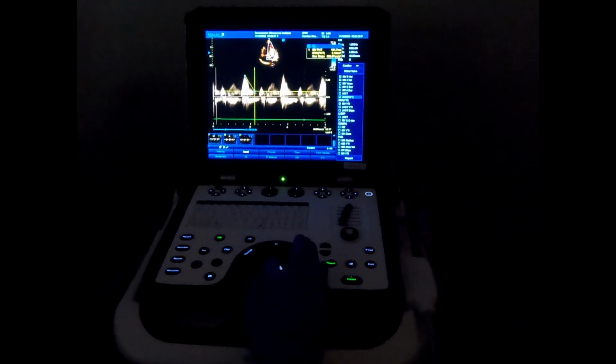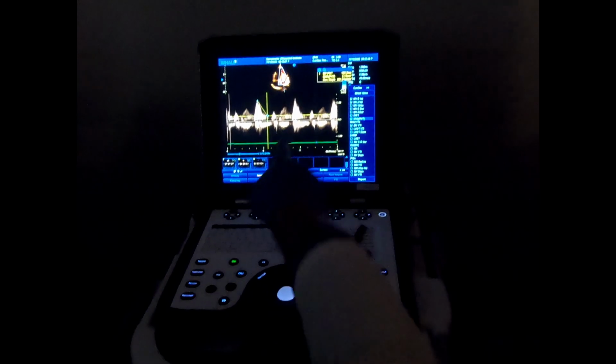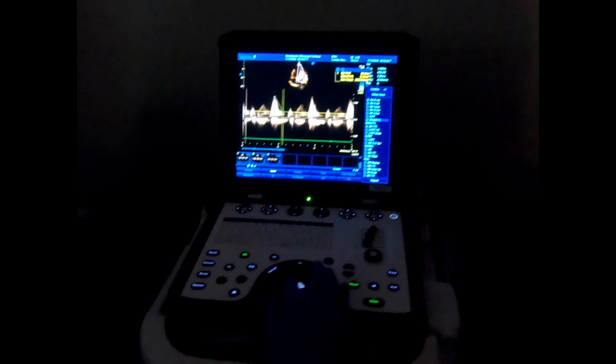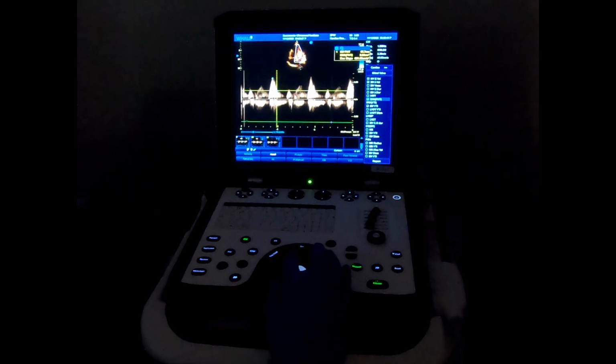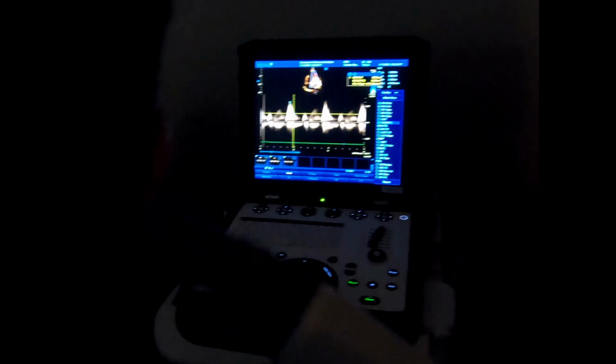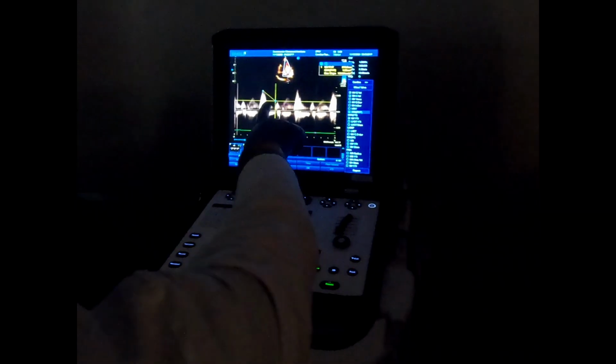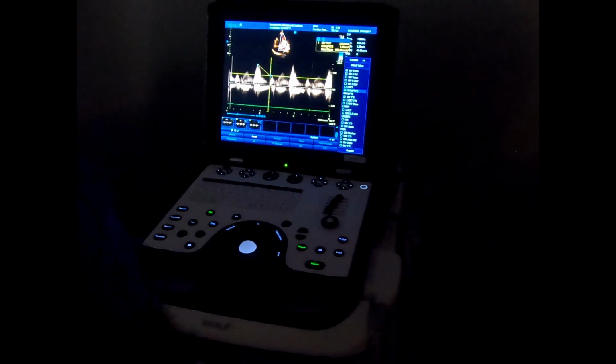This is not your pressure half time because that will create a gap. That will change the valve area, and it is now almost a stenosis. So your next stop is at that indentation. Follow the initial slope. Initial means from the peak. Once you see the slope, you follow. That's more reliable. The slope at the bottom also creates a slope for you, but not that one.